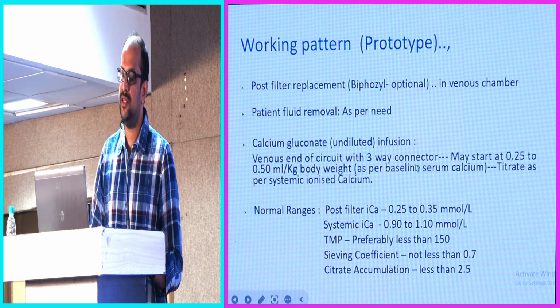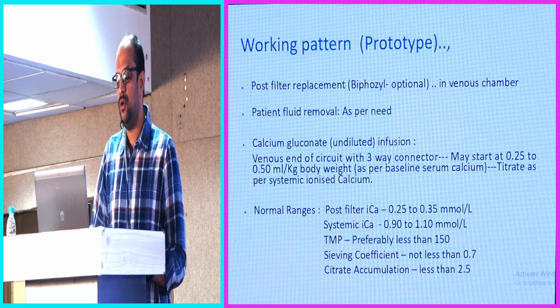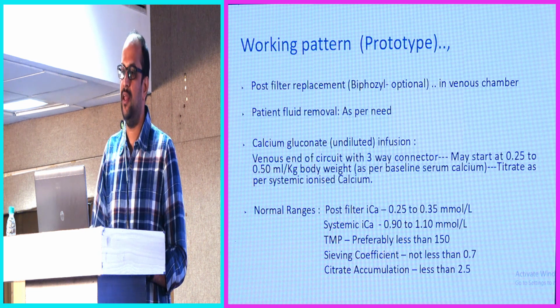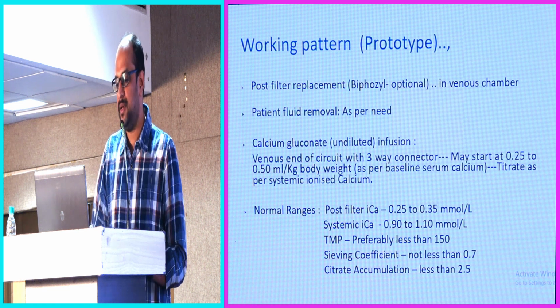So coming to the post filter replacement, it is optional. Initially, as a default prescription, we won't regularly use post filter replacement fluid, but if the condition demands, we can use it, and the fluid that we use is bicarbonate. And ultrafiltration will be based upon the patient's clinical status. We will remove it as per the requirement.